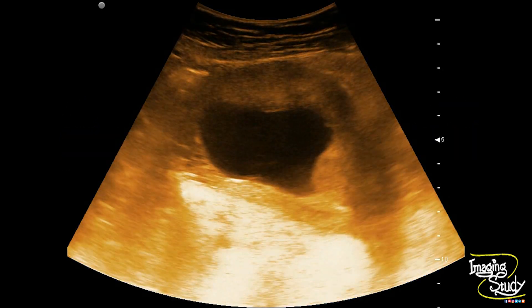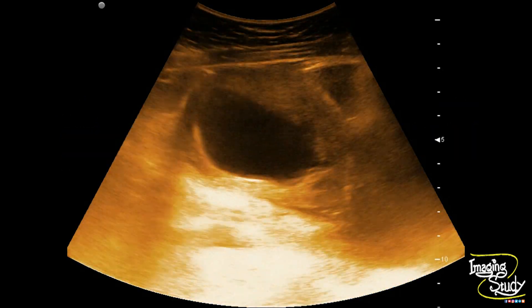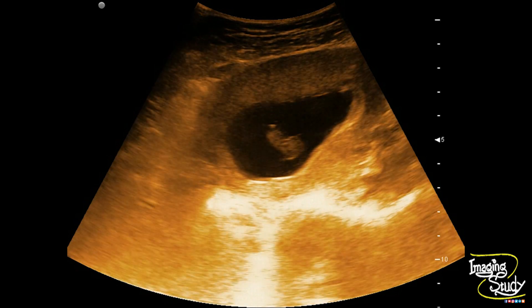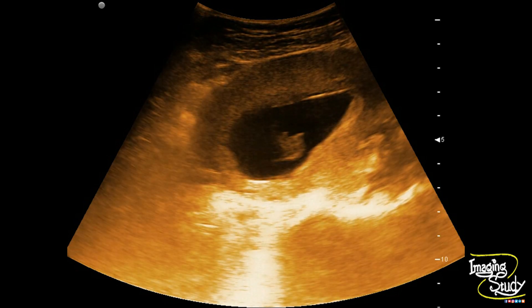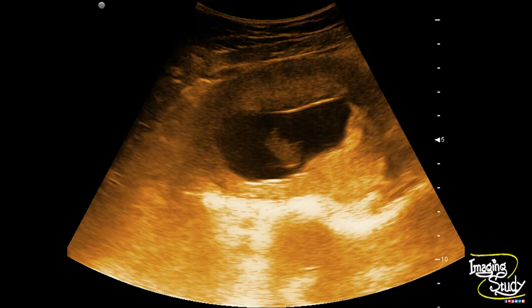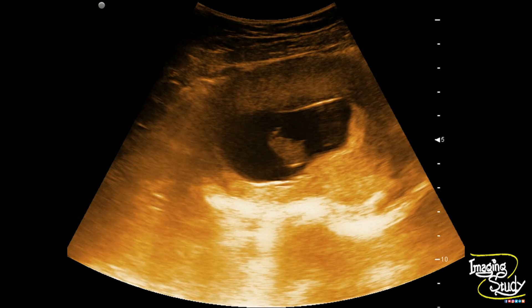Here you can see the uterus containing a slightly irregular gestational sac. You can see an embryo within. There is no visible cardiac activity of this embryo.